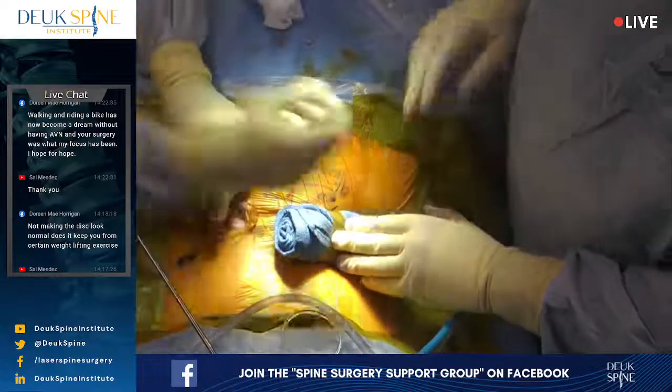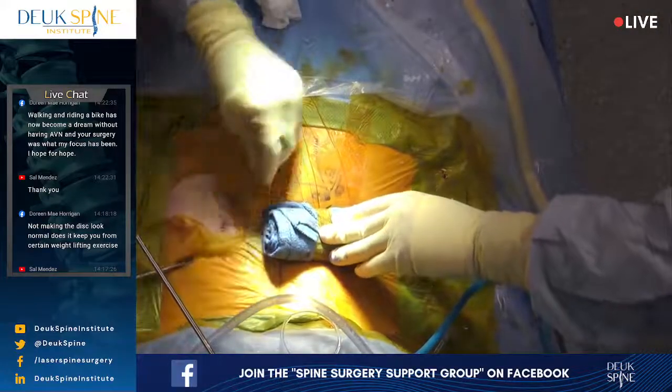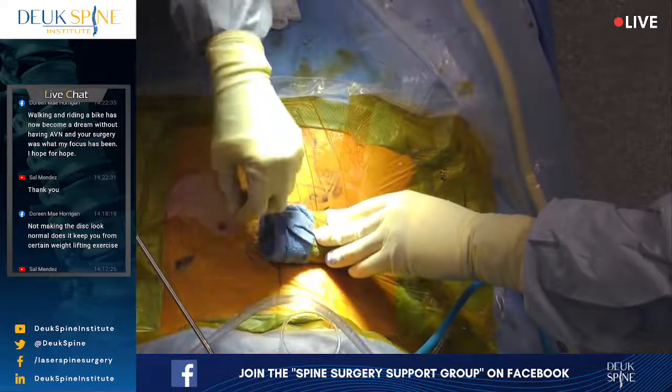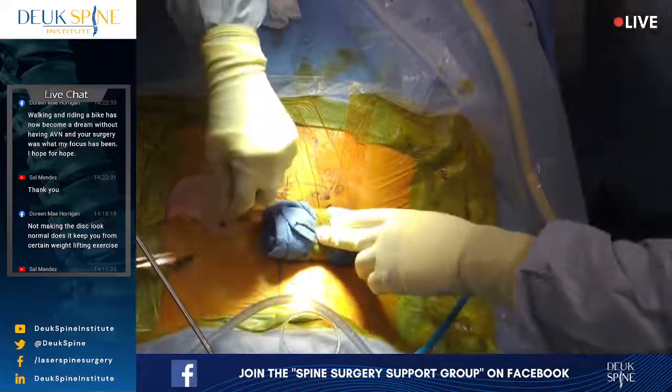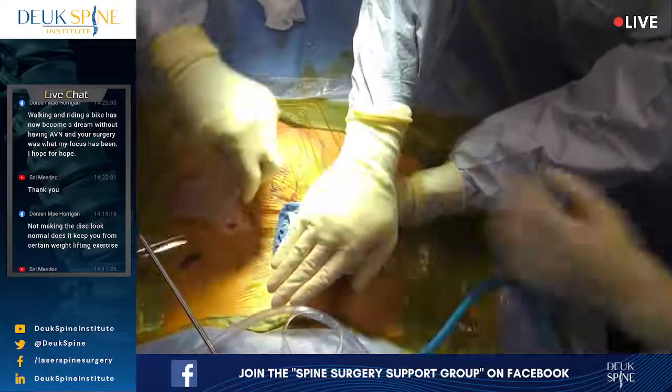Pressure. I got it. Come over here. Are you still sterile then? Yeah, still sterile. Come on, get here. Put your hand here and put pressure. You want to put about that much pressure. Okay?